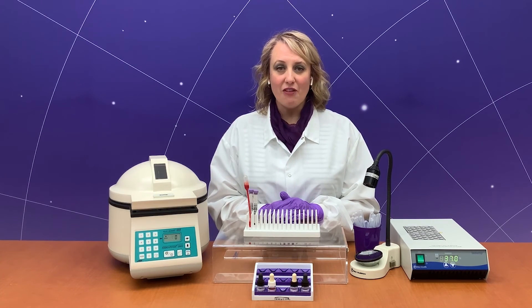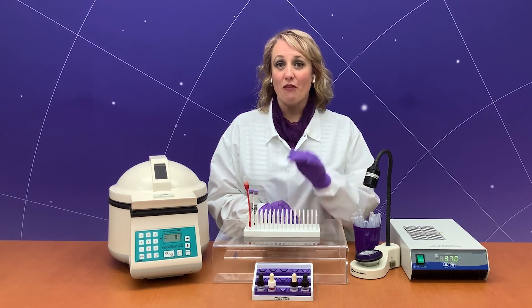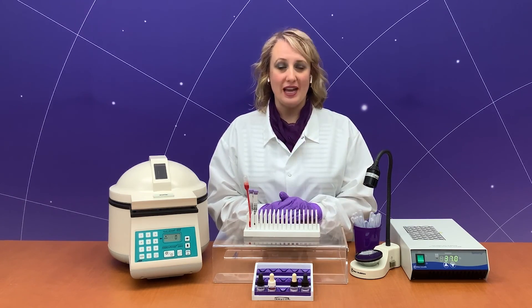Remember the key to the FMH rapid screen kit: incubate for five minutes, examine five low-power fields for five agglutinates — that's a positive result.